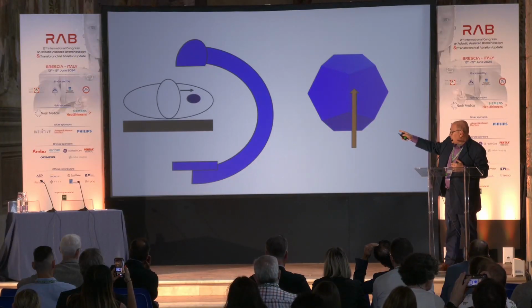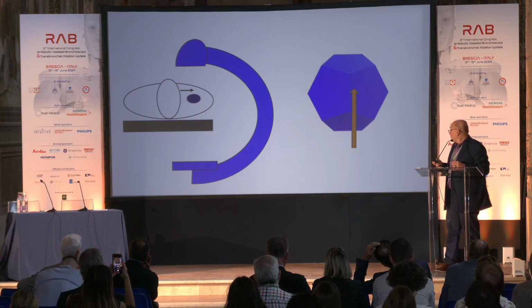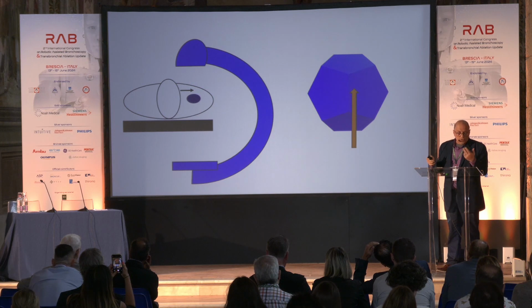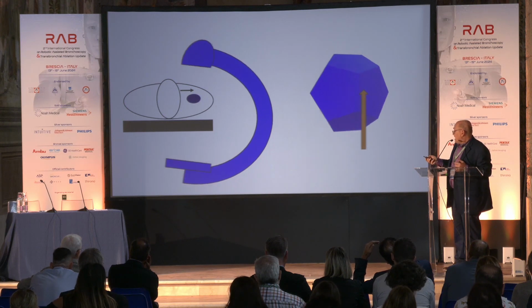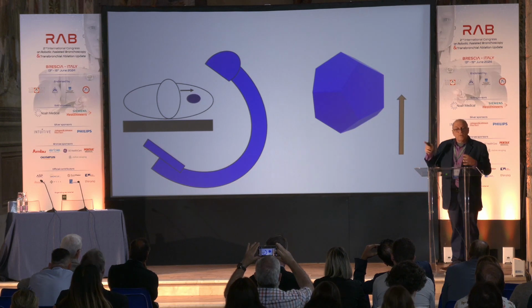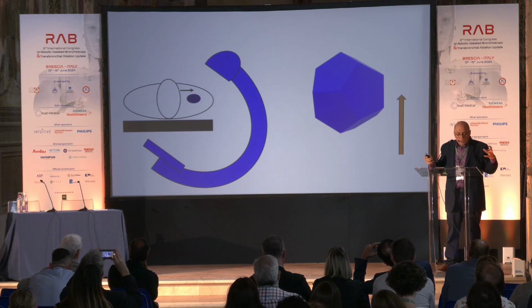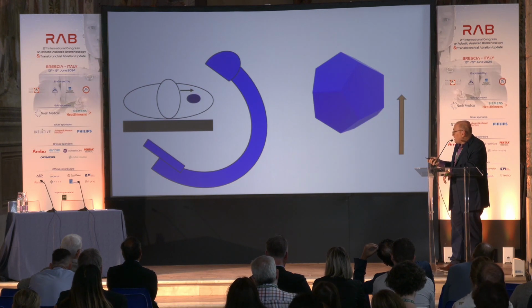This is a cartoon graphic representation of what we were looking at yesterday, where the blue dot is the nodule, the arrow is your biopsy tool or your scope, and the image that you're seeing on the fluoro screen would be this over here on the right. You could see that if you're in front of the nodule, when you do your spin, your tool just moves out of range. We see that sort of all the time. We saw that a little bit yesterday during our case.